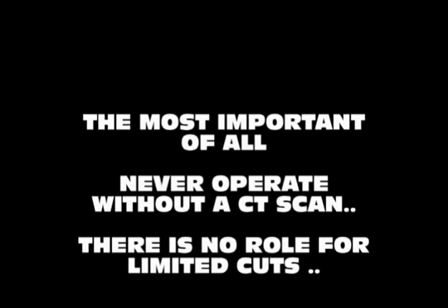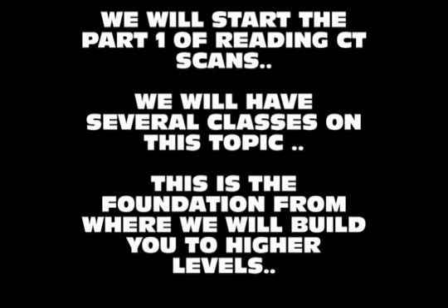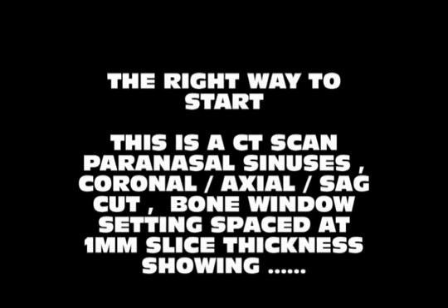The most important of all, never ever operate without a CT scan just because he can't afford it. You will land up in the court of law. There is no role for screening CT. We will start the part 1 of reading CT scans. We will have several classes on this topic, and this is the foundation on which you're going to build up.